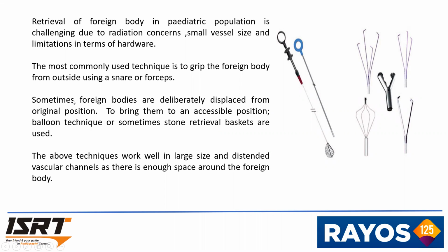Sometimes foreign bodies are deliberately displaced from the original position. To bring them to an accessible position, balloon technique or sometimes stone retrieval baskets are used. This is a stone retrieval basket. The above techniques work well in large size and distended vascular channels as there is enough space for the hardware to get in.